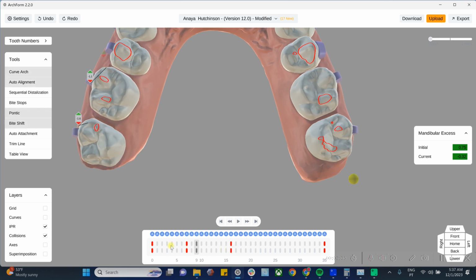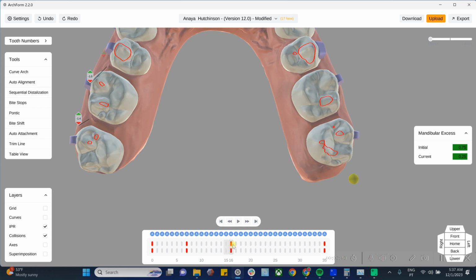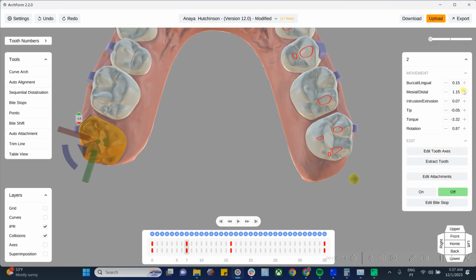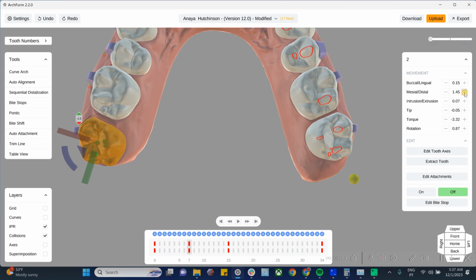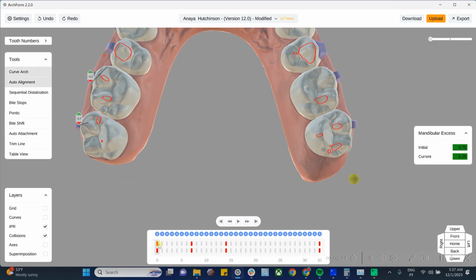And just seeing that, now you probably would have noticed we tried to set the goal at 14 and now it's jumped to 16. So we can perhaps increase the speed here to bring those number of steps down. And there we go, it's to 14.